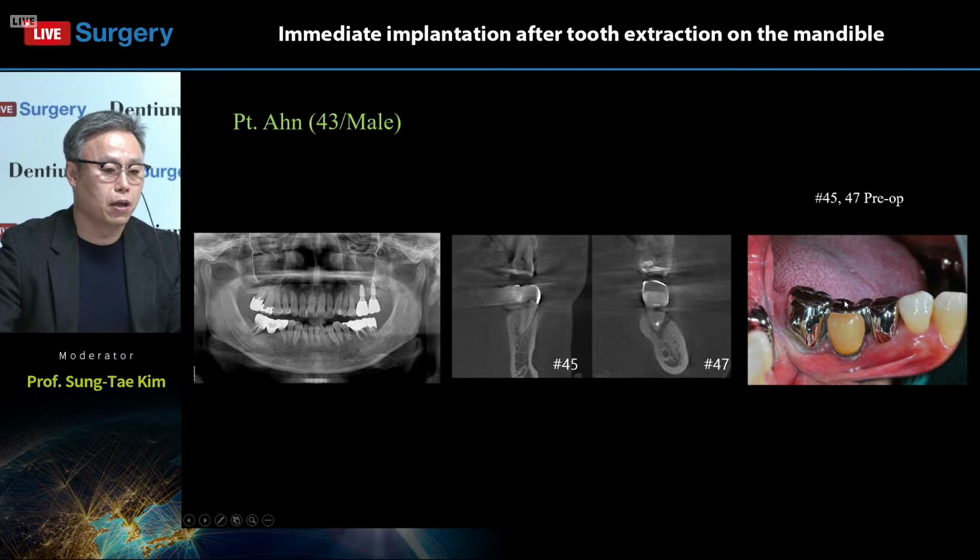This is a clinical photo. It's a defective restoration, and you can see some inflammation of the gum and also some bone loss.